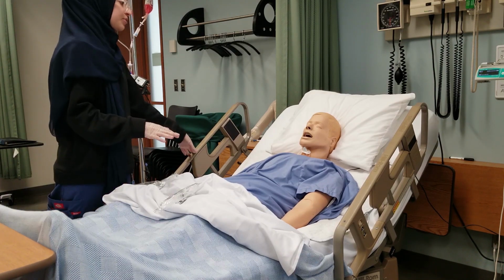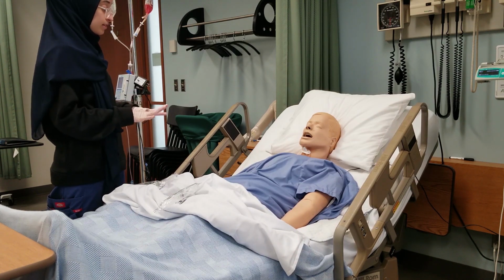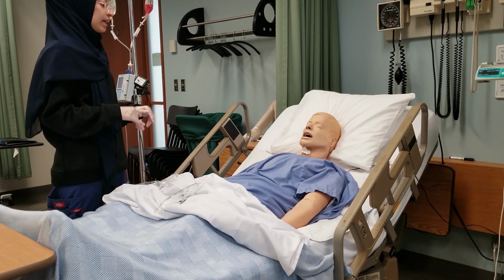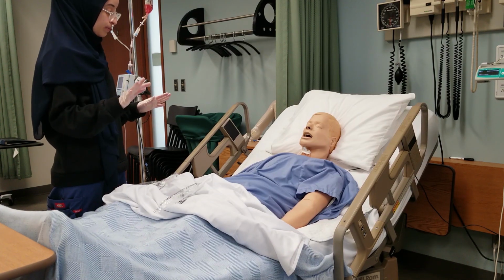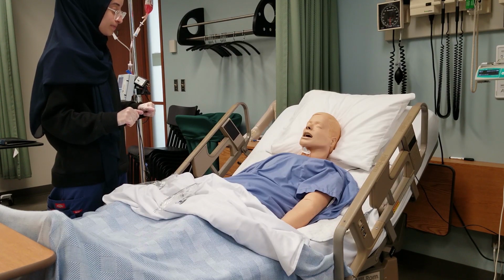So the infusion is running. I'm just going to stick around here for 15 minutes. We're running it very slow to begin with, just to see if you have any reactions to the blood. And then once we've ensured that there hasn't been any reactions after 15 minutes, I'm going to take another set of vitals, and then we will change the rate, and you can just take a nap if you want.